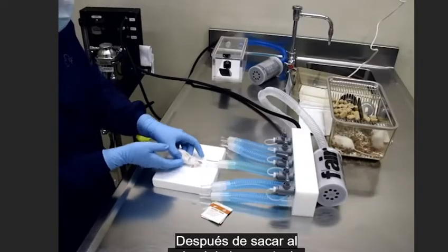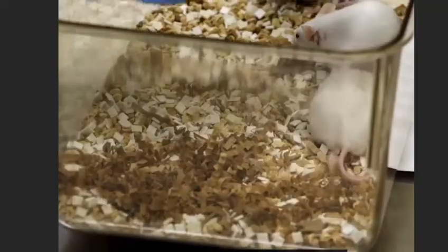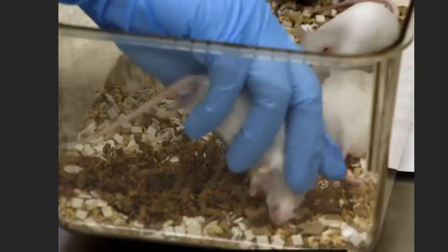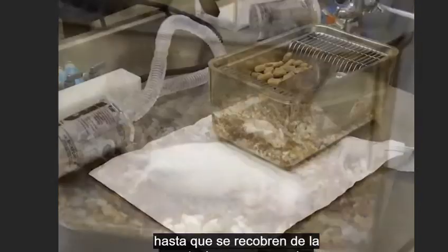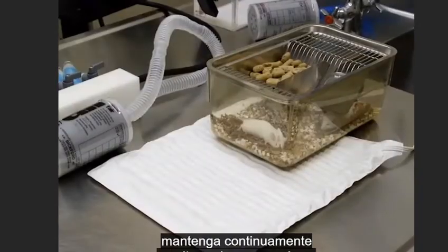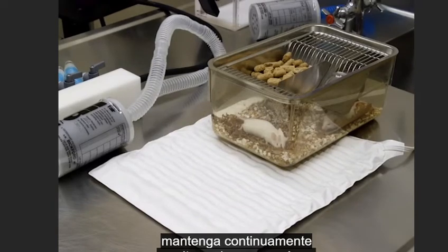After removing the animal from anesthesia, it should not be returned to the housing facility until recovered from anesthesia, unless it is continuously monitored in the housing area.